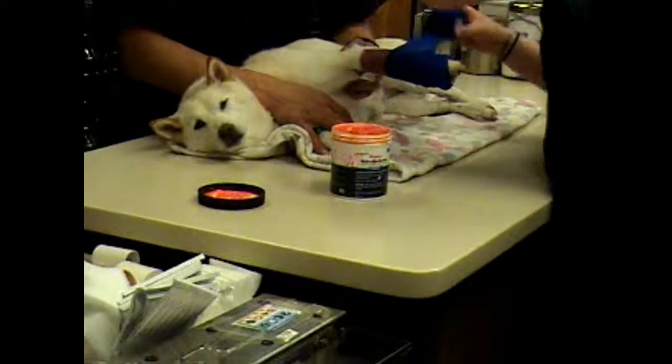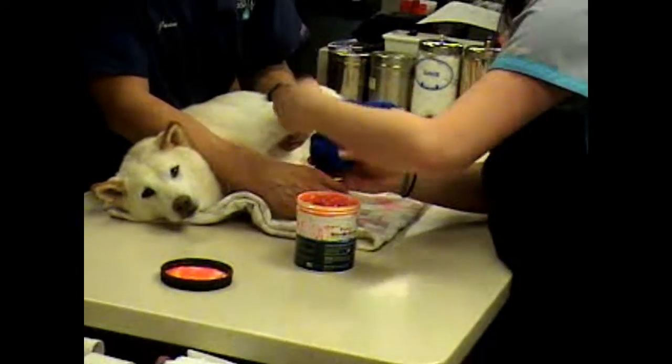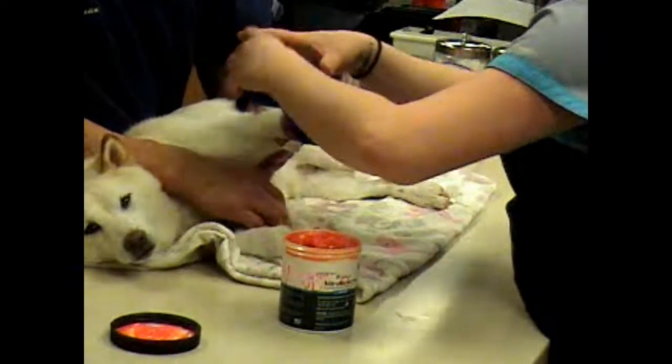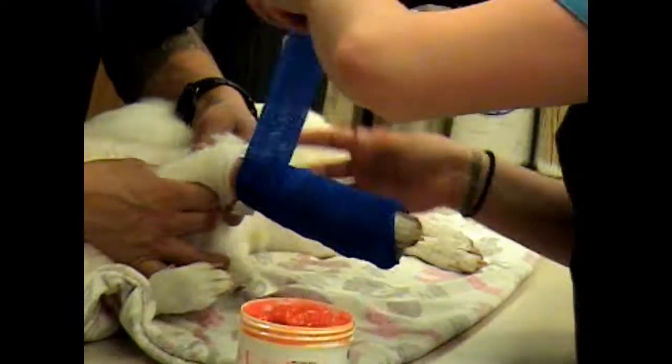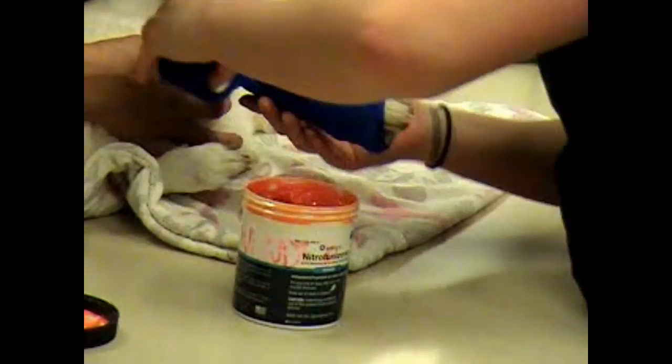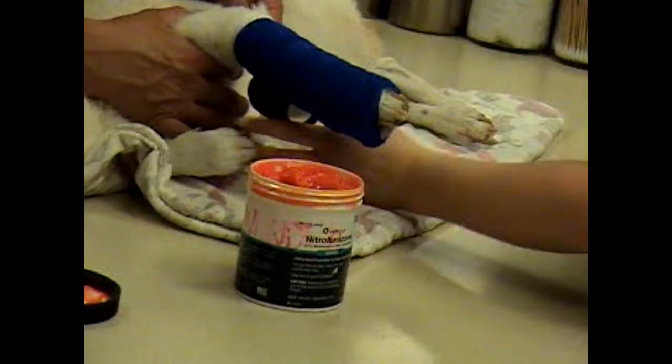So each time, not making it too tight — just pulling it and laying it over about 50%, coming on this layer about halfway up, and just pulling. And then I'm just leaving a little bit of that cotton showing up top there.